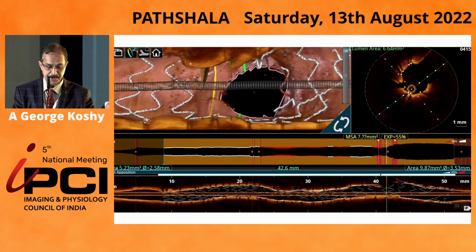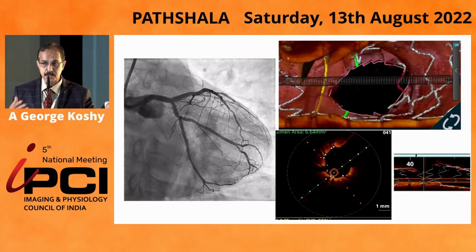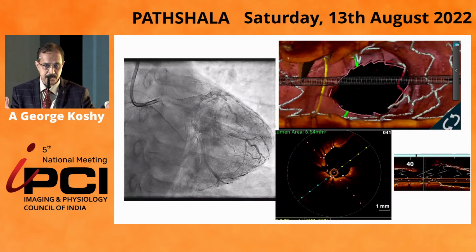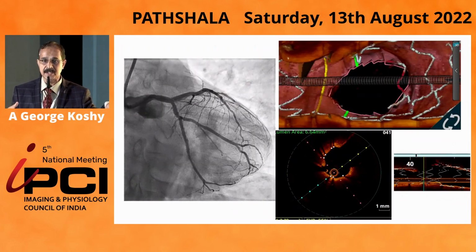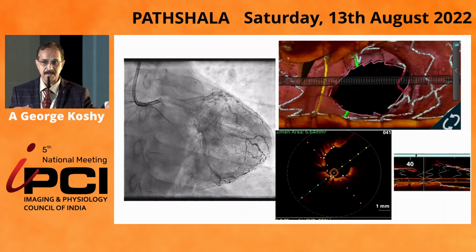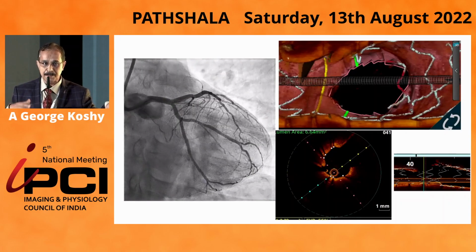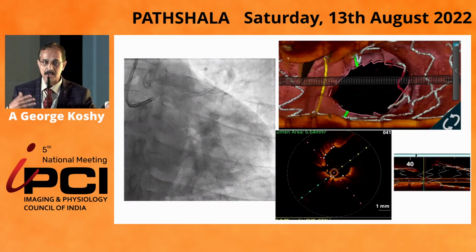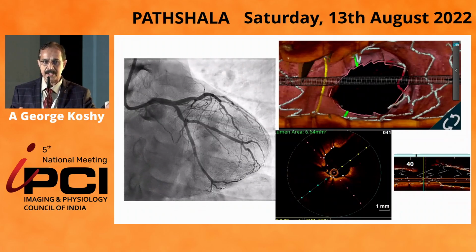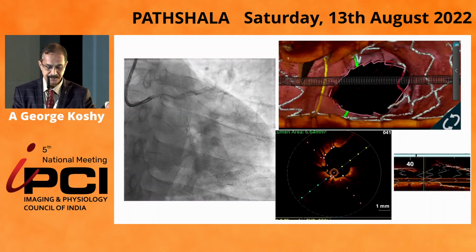So that's the important point, which becomes all the more important in a two-stent strategy, as has been discussed today in the DK crush. It was pointed out already the DK crush has a lot of steps, and if you start doing it in a very perfect manner, it requires a lot of hardware, a lot of time, a lot of contrast, but okay, there is some suggestion that it may yield a better outcome.